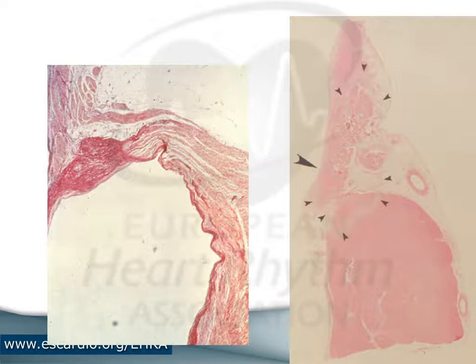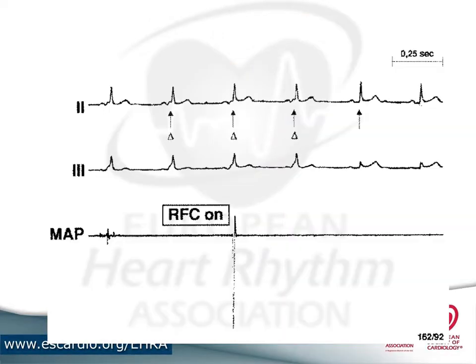And my final slide is going to say, attempt a hole in one, which is a quote that I give to Edward Rowland, whom I saw doing a very nice case. So this is the slide that I, again, got from Karl-Heinz, showing one of his first ablations of accessory pathways. Single catheter at that time. You see the time code here, patient number 162 studied at Eppendorf in Hamburg in 1992 with a single catheter. He's very happy with that single catheter approach, which only works, obviously, with a patient with pre-excitation. Otherwise, you don't have enough places to stimulate from, but you can do it.